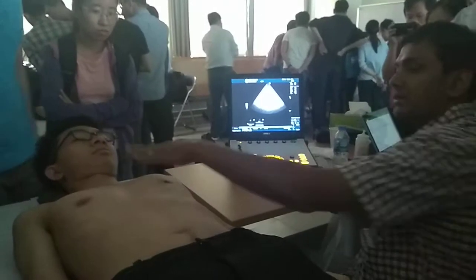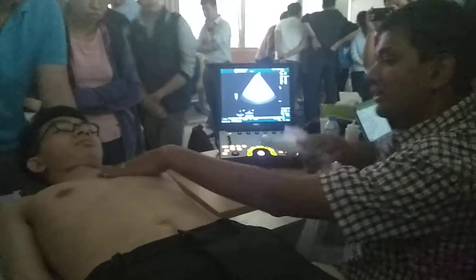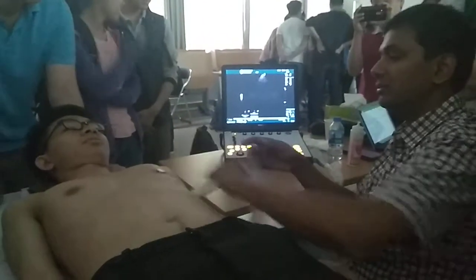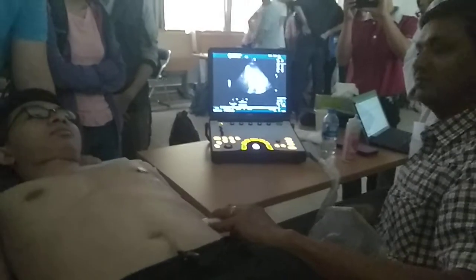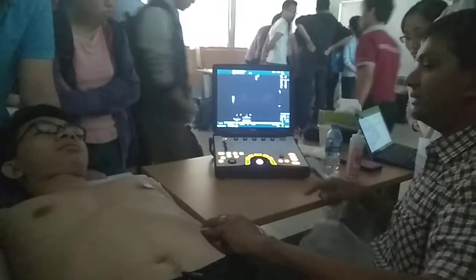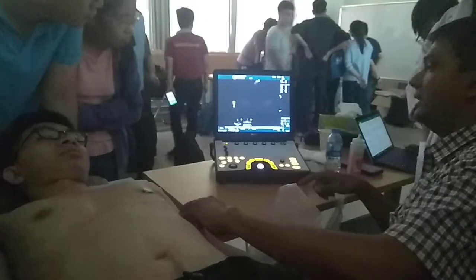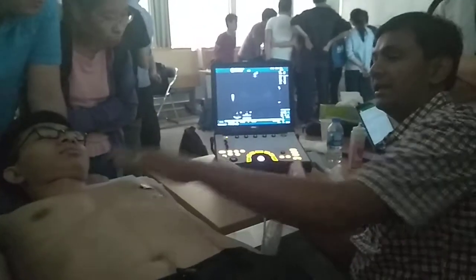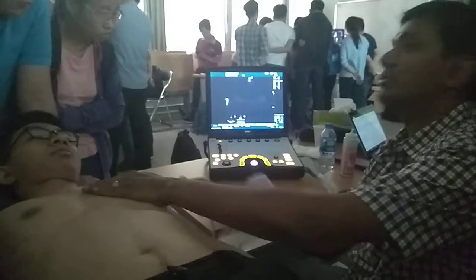So that's the apex of the left ventricle. Now, that's the heart, and you want to go from below. So what I will do is deliberately go to the abdomen. No, that's the spleen. Then slowly I will keep going superiorly. And I'm in lung. So no heart. So the heart is here. I started in the abdomen and there's no heart.